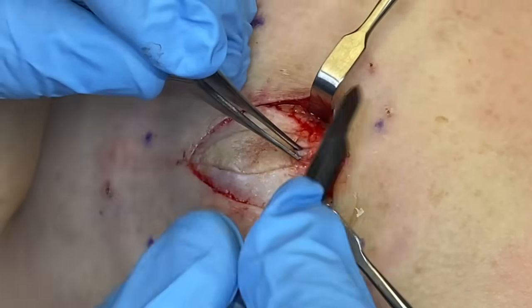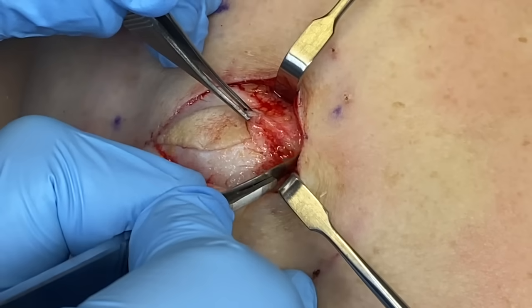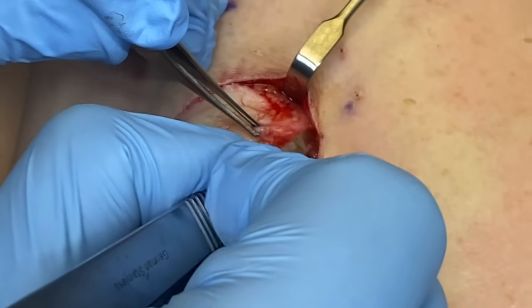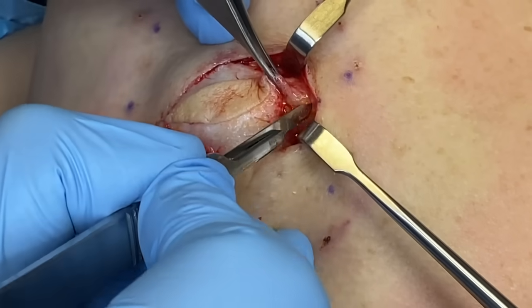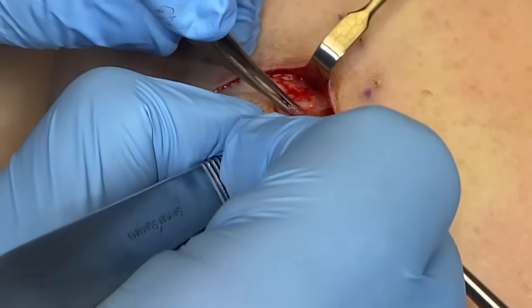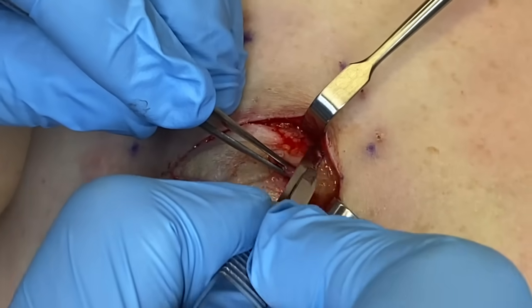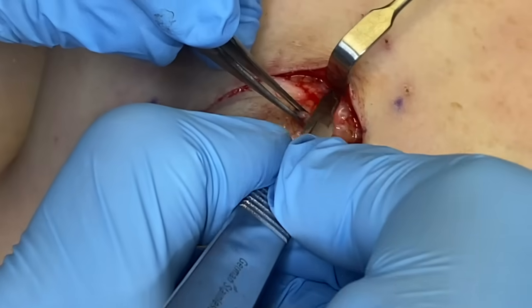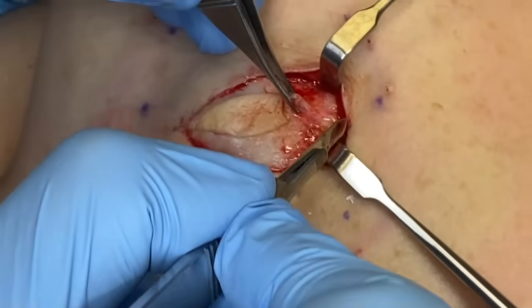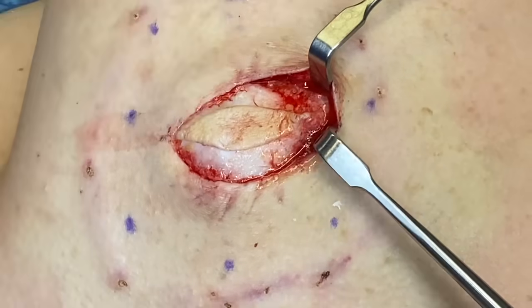And again, what I'm looking for here is we're trying to dissect down to hypodermis. So this is where I want to see if I'm getting to the right level, that we're getting a fatty layer there. See that here, it's starting. Because that's what I want to be seeing, so I can get back around behind it and then start dissecting in the other plane. So we know we're deep to it on this corner. Yeah, on that corner we are.